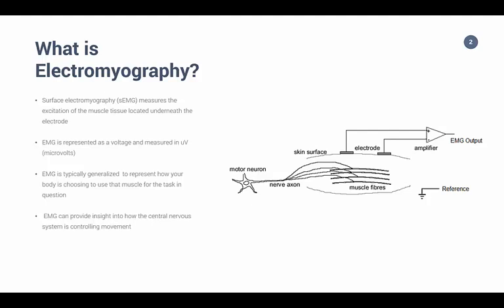Electromyography deals with the detection, analysis, and utilization of electrical signals emanating from skeletal muscles. The electric signal produced during muscle activation, known as the myoelectric signal, is produced from small electrical currents generated by the exchange of ions across the muscle membranes and detected with the help of electrodes. This signal is represented in units of microvolts.